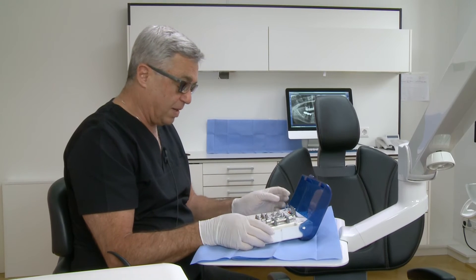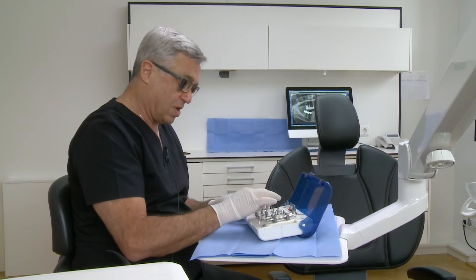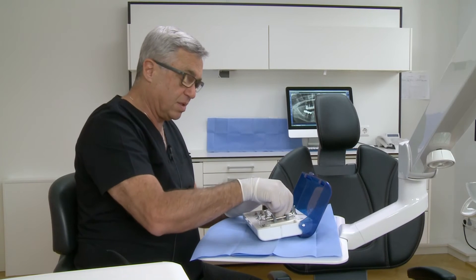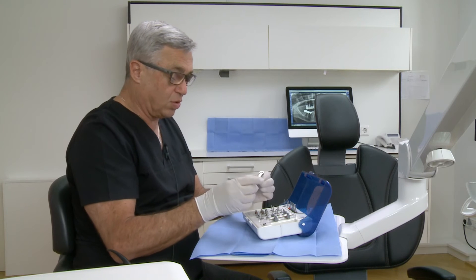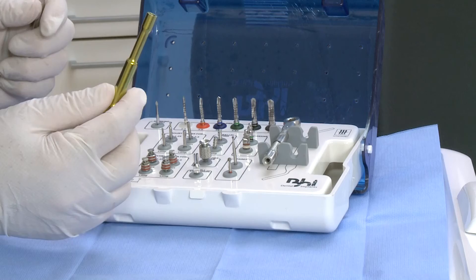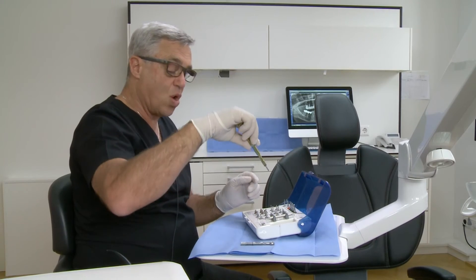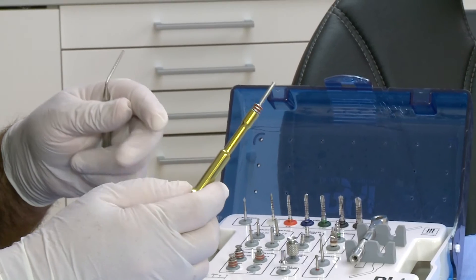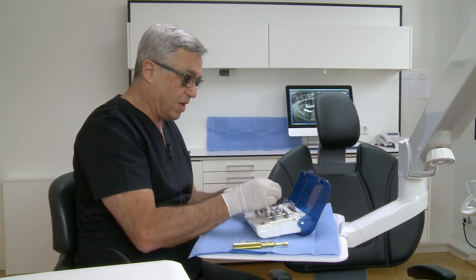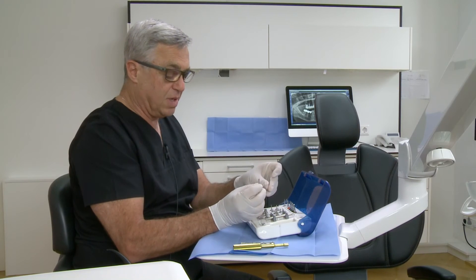In order to introduce the implant, we need the hex — a 2.5 mm hex. We have a short one and a long one, using the ratchet for insertion. The torque ratchet, or in the upper jaw, I like to use the handle. We can use the handle and introduce the implant — it has to stick tight into the handle. The other possibility to introduce the implant is with the handpiece, the angulated handpiece. It has a long and a short 2.5 mm insertion tool.